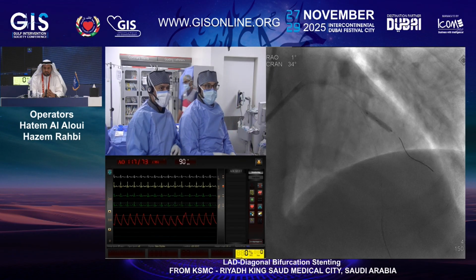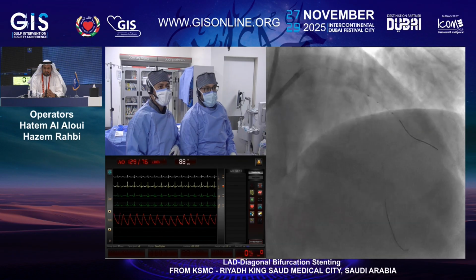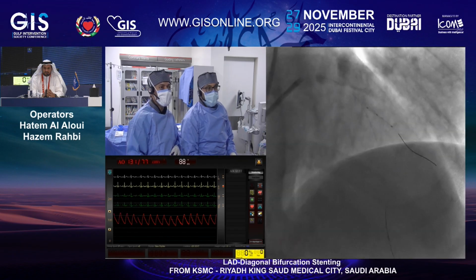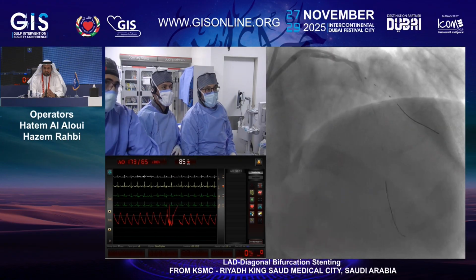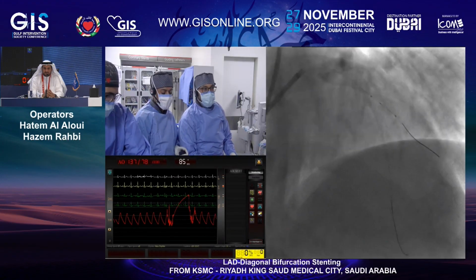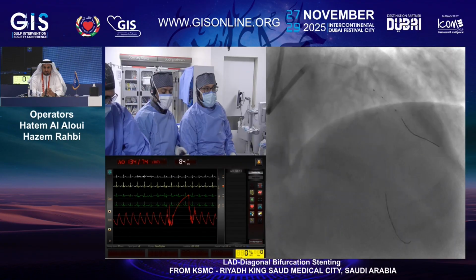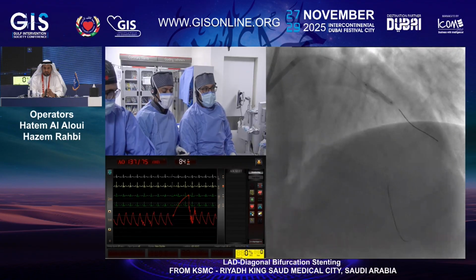It's a 3.0 vessel. Yes. So we are at probably 0.5 to 0.8 to 1. Small test, please. We'll do a prolonged inflation. Go up again, please. Eight.